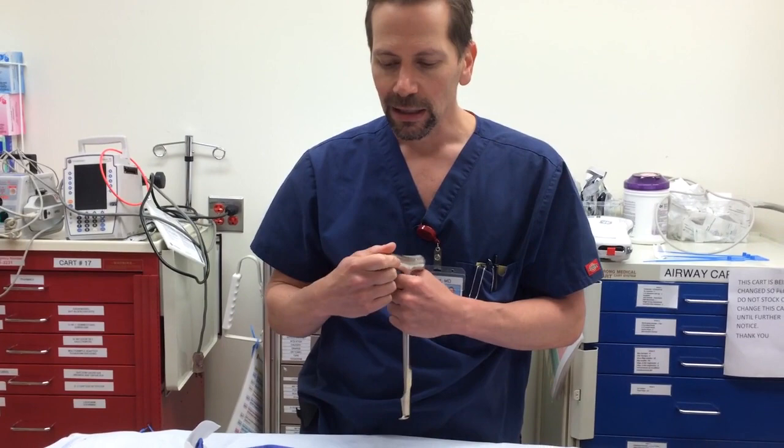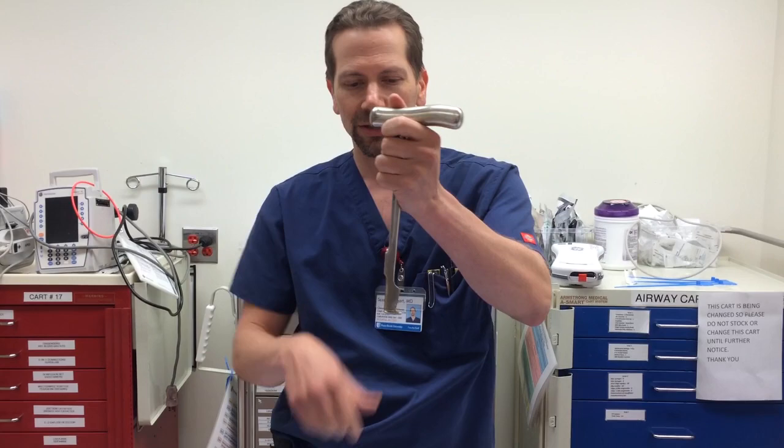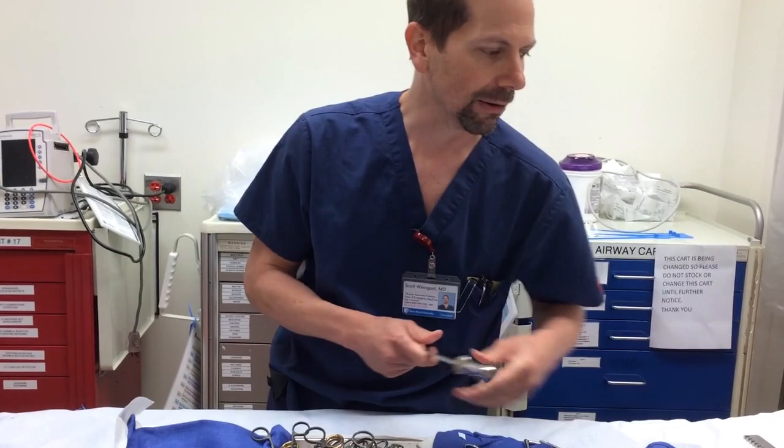I recommend inexperienced folks do a clamshell thoracotomy because it gives the biggest exposure and is much easier than looking in the dark cave of an anterolateral thoracotomy. For that, you want a Lebski knife, which latches under the sternum, and has a blade that touches the sternum — it doesn't need to be sharp. Then there is a hammer you hit the Lebski knife with, and with two smacks you're through the sternum. You definitely want one of those.